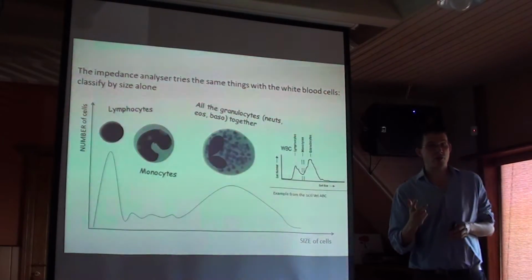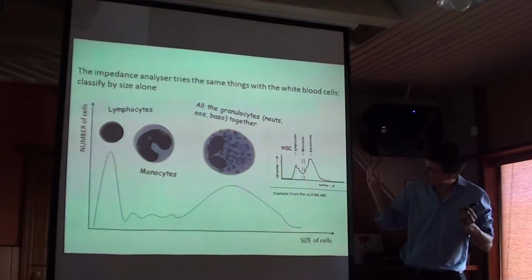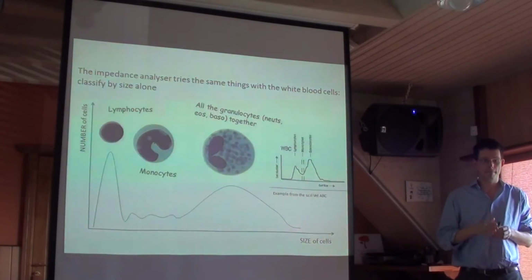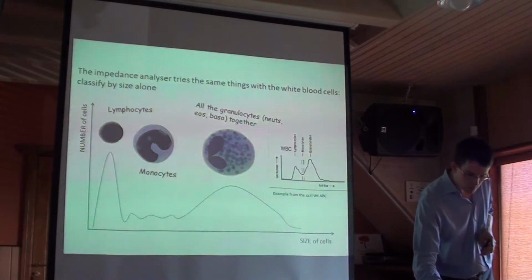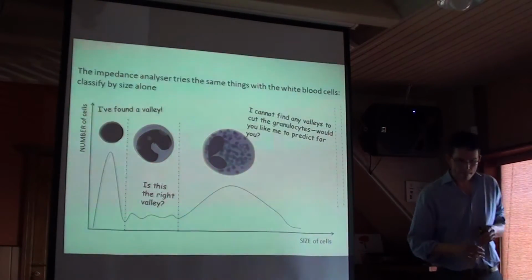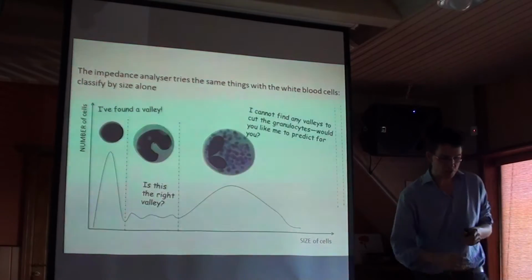Remember, we are looking for 3 hills, 2 valleys. Here you can only see 2 hills. Maybe there's an extra hill there. I don't know. But both lines have been placed in the middle of that one valley. Tüüpiliselt me siis otsiksime 3 küngast 2 vahekohaga, mis siin tegelikult on 2 küngast. Kus on see 3.? Ei tea, jooned on suvalisse kohta pandud. Essentially you're looking for a hill for each part of the differential.